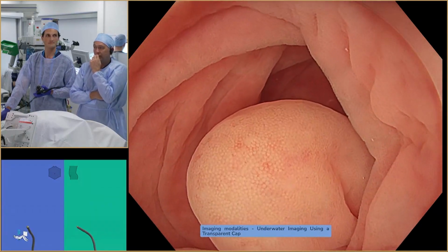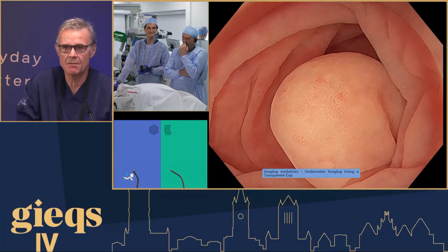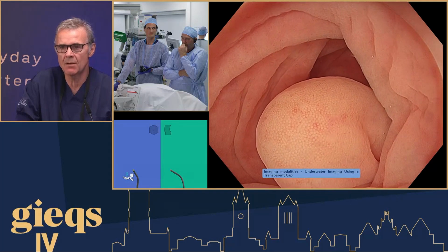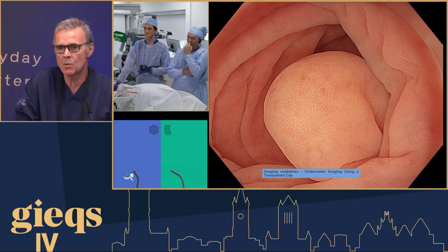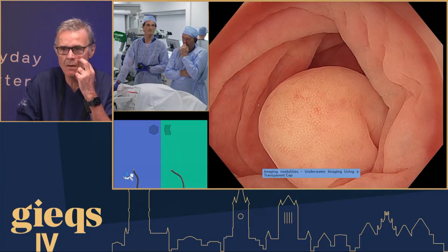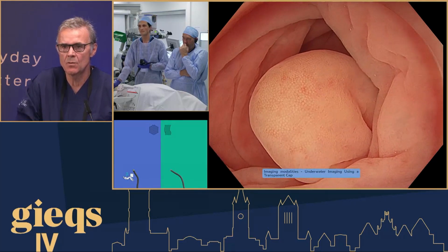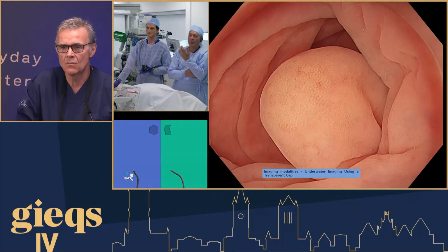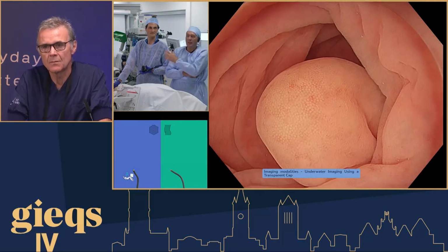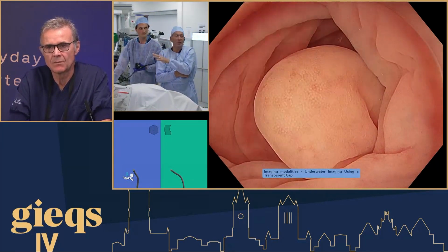So, John, the last pneumatosis I saw was 20 years ago, and I'd seen maybe 3 or 4 before that. They were characterized both endoscopically and radiologically by multiple small submucosal air pockets, not 2 or 3 big lesions like this. I've not seen this or read about 2 or 3 big lesions caused by pneumatosis. I agree, but give me a different diagnosis. We can resect this. We'll do the patient no harm in resecting this. We can lift it and remove this, but I think it will just simply deflate.